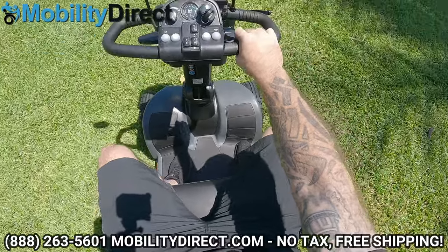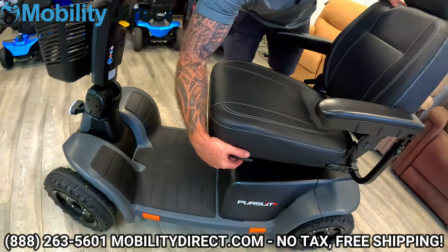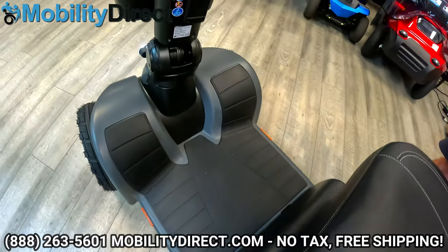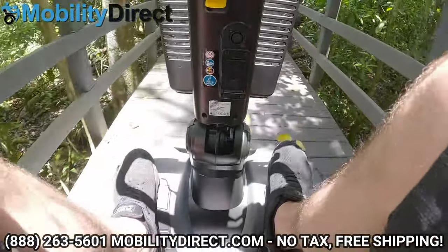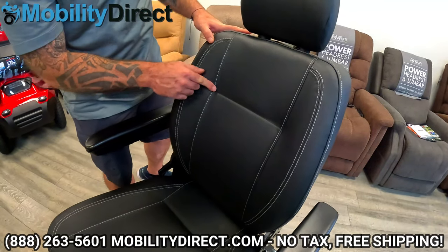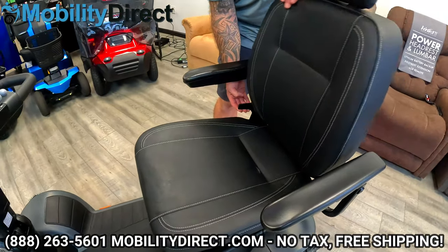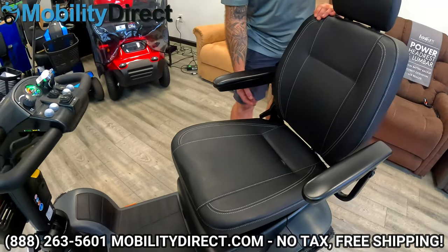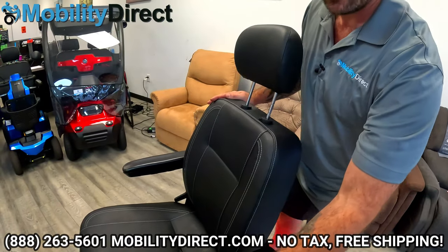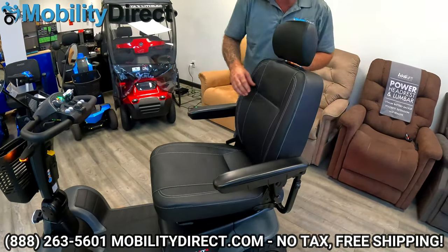We have a very spacious floorboard. If you're tall, you can adjust your seat because it has a sliding seat — so if you put the seat all the way back, you have even more room. I'm almost six feet tall and I fit on the scooter with ease. Moving forward, as you can see, you have some nice contrast in the stitching — black seat, white stitching — and it's also water resistant, which is very nice. The seat folds down, and the headrest is also adjustable. The seat has a very nice, comfortable memory foam — very comfortable for those long rides.